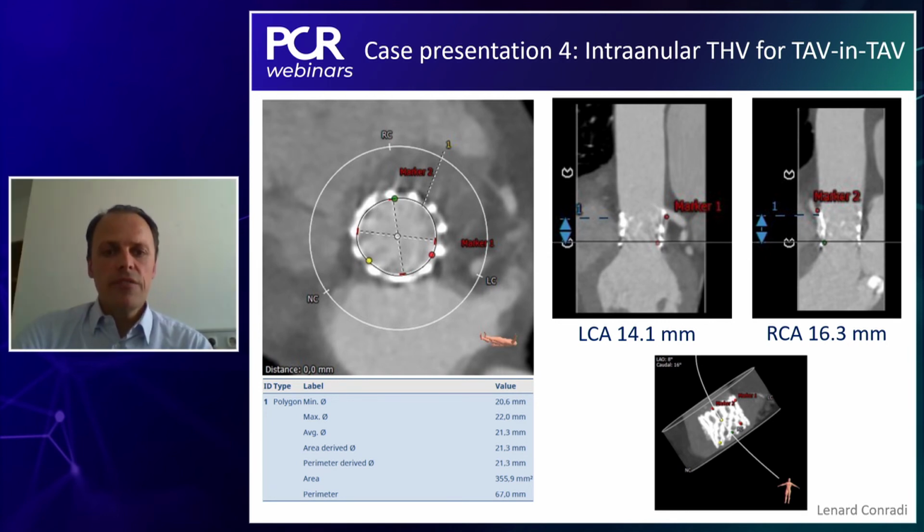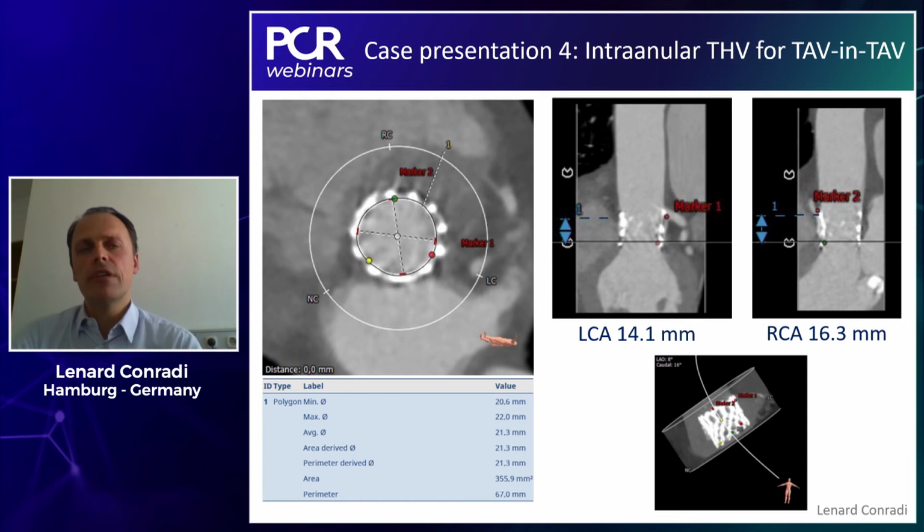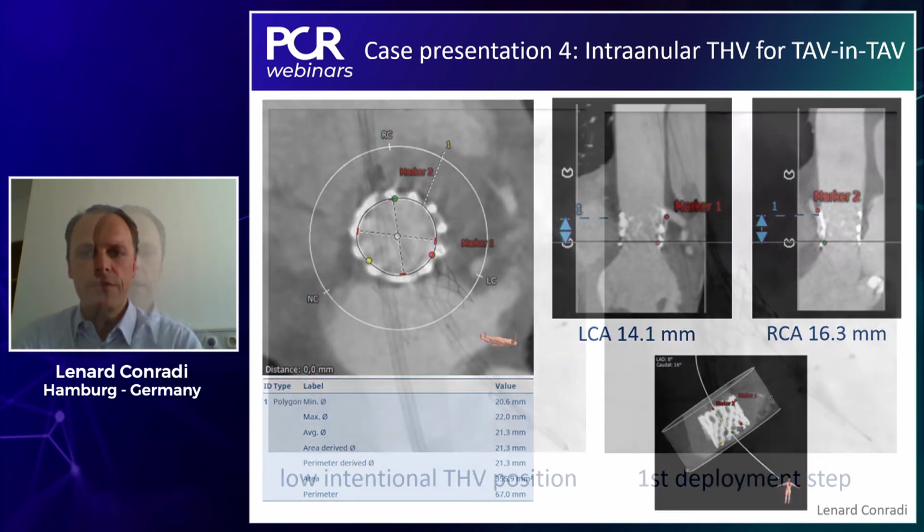Yeah, these are exactly the thoughts we were having. So the first decision was easy, following your rationales, Flavio and Henrik, that supraannular wouldn't really trade off in a beneficial way or might even be harmful. So when left with the decision for an intraannular valve design, we decided on self-expandable because of the repositionability. Of course, a Sapien technically would be insertable here, but on the other hand, just to add to the potential safety of the procedure, we went for a self-expandable.